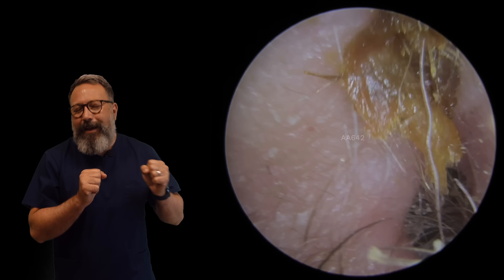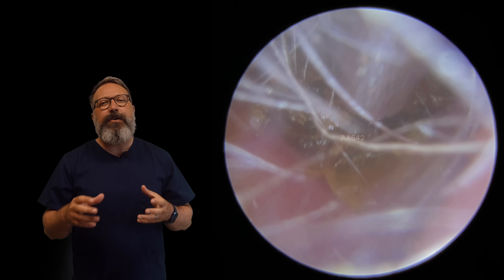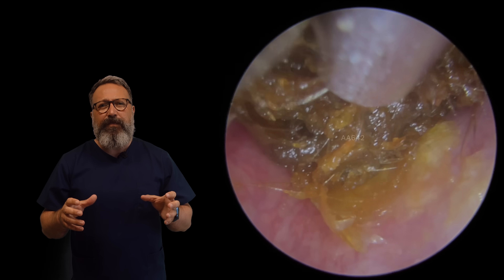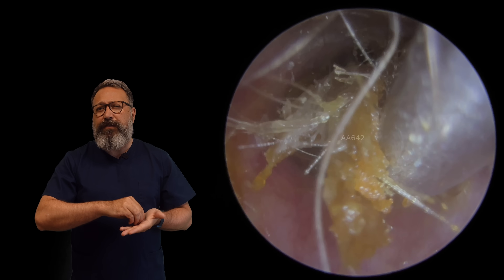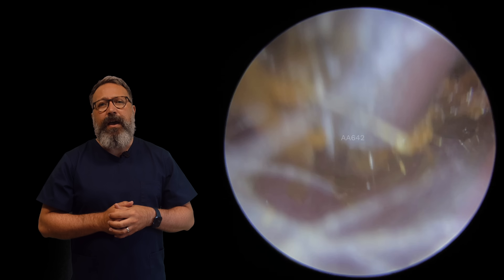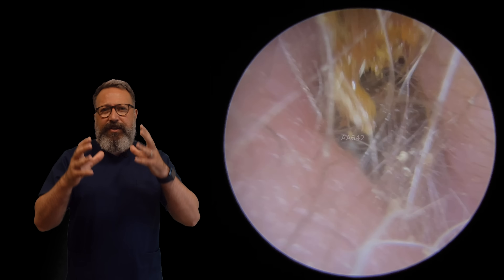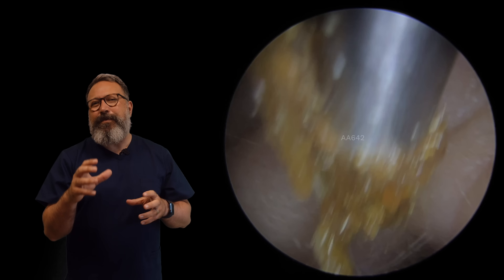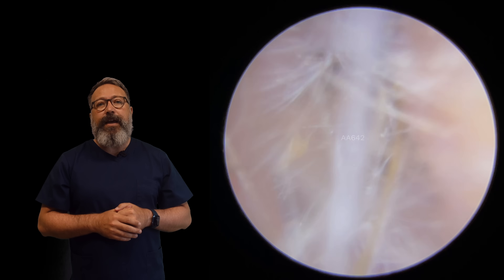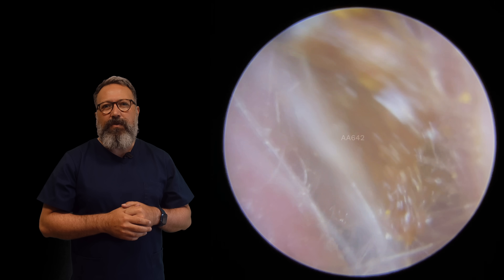We always have to be a little bit more careful when we're down in these deeper sections because this is really uncomfortable for the patient if you press on the canal wall — it would feel like a really sharp scratch. So I'm just very gently working on this central portion of wax, very gently teasing this down the canal. There's a little bit of wiggling involved in a minute as well to get this out, but we're managing to get this coming away really, really nicely.